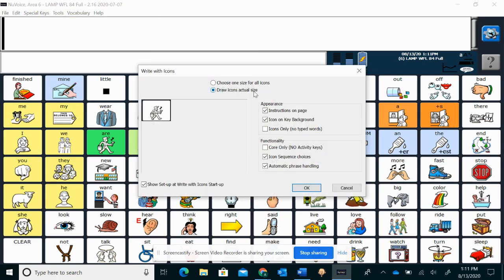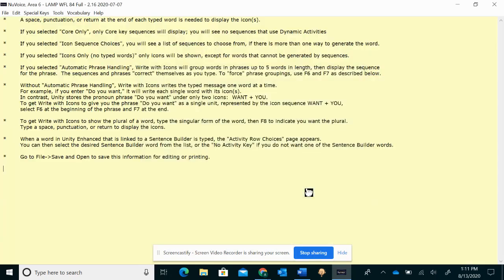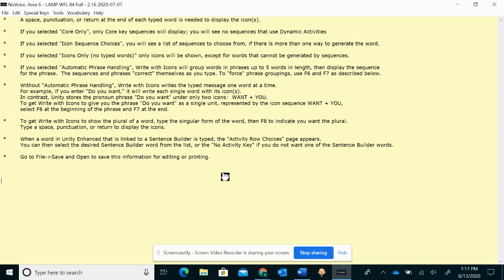This will be Draw Icon's Actual Size. Or you can choose a size. I'm just going to leave it how it is for now. Gives you a little background on everything. You don't have to worry about that. If you want to read it, great. If not, you can erase it and just start.